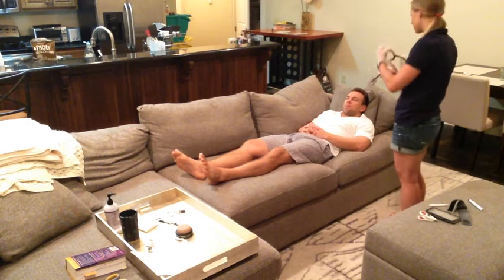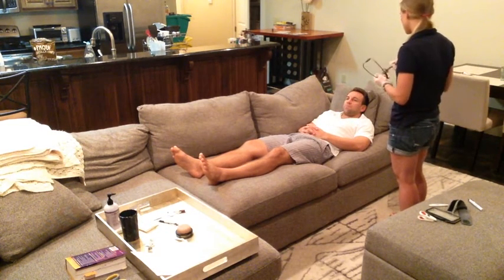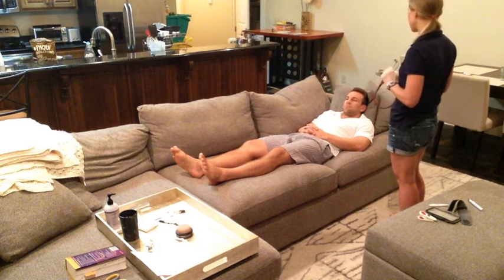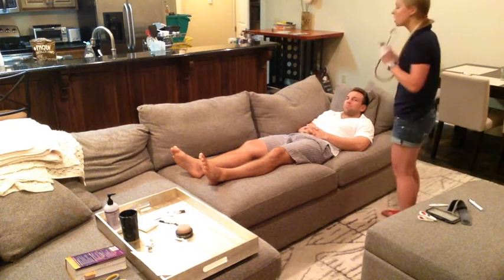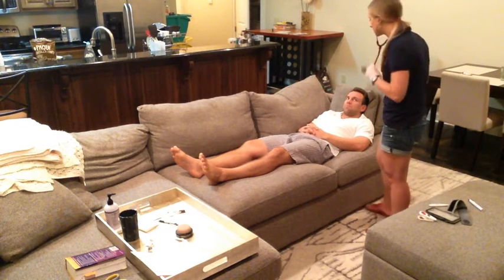So I'm going to listen to your breath sounds. So every time I put my stethoscope on your chest, if you could take a nice deep breath in and out for me, that would be great. Also, we would do this with the shirt off. Of course, we're going to leave it on for this.